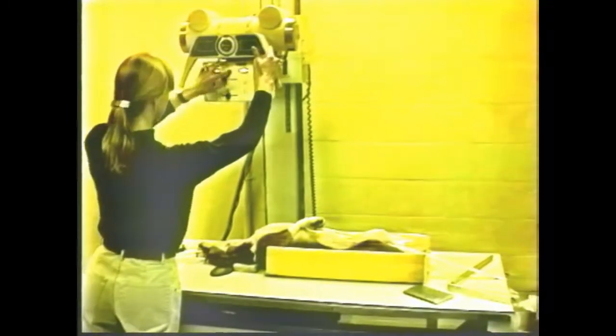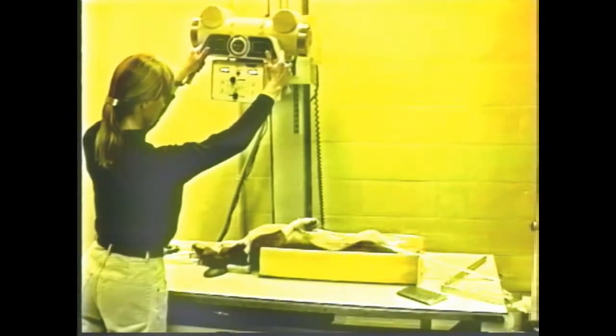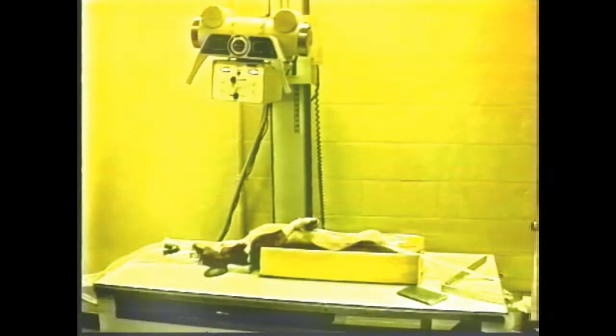We are showing that the tube is now removed so that we would not have the confusing shadows of the endotracheal tube over the cervical vertebra. On the lateral view, you can see that the animal is positioned properly, and one of the adjustments which can be made which assists the quality of the radiograph is to angle the tube slightly so that the primary beam is more parallel to the intervertebral disc spaces.